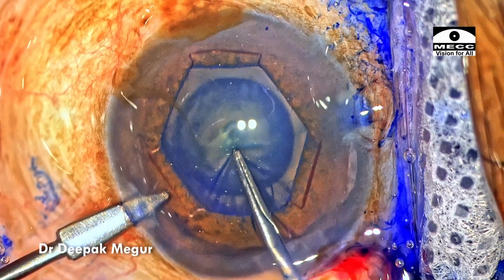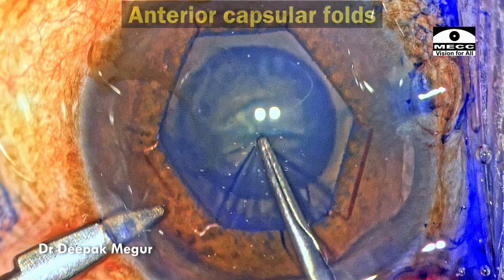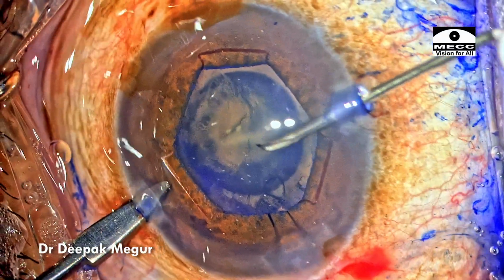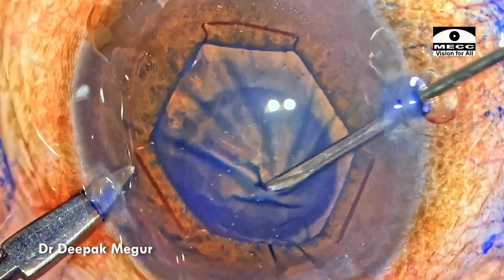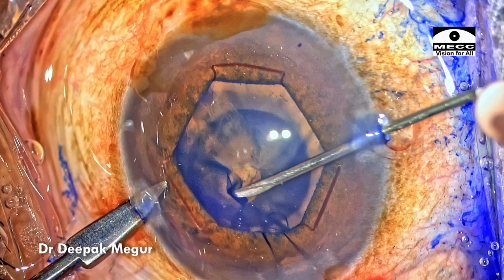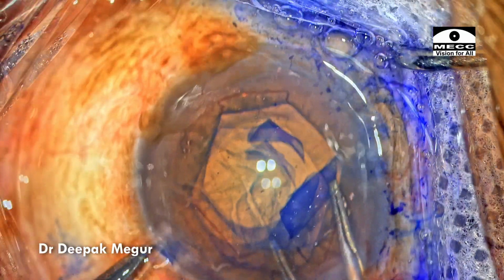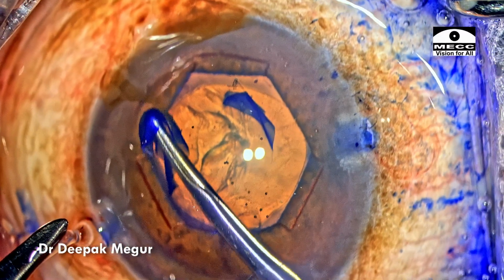We can see these radial folds emanating from the puncture site, suggesting that there is gross zonulopathy in these situations. The relatively blunt tip of the rhexis forceps will not work. I'm resorting to the 26 number needle to puncture the capsule. Even when the puncture is being made with a sharp needle, you can see the radial fold suggesting weak zonules. Once the flap is raised, the rest of the rhexis is being managed with the help of a capsular forceps. So in eyes with zonular weakness, the forceps gives us better tension and grip to tear these capsules.